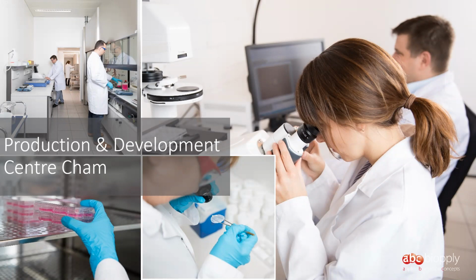Later on, when the spheroids actually have grown enough, you can even see the spheroids because they become big enough. So it's even possible on a black background then to actually see the spheroids sitting in the individual microcavities.